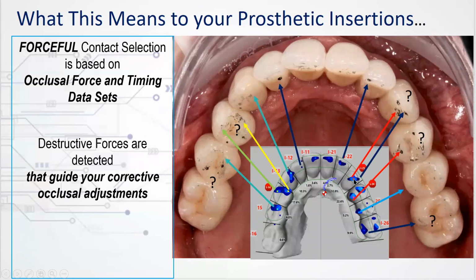Here you have a high force on this canine on the 2-3, and you don't see any paper mark there. Again, the paper doesn't stay sometimes under high pressure. It's sort of surrounded by low pressure, which is what you're seeing here. And next to it is a mark that is high force, but it's no darker than that lateral incisor mark, right? That's actually lighter than that lateral incisor mark, right?